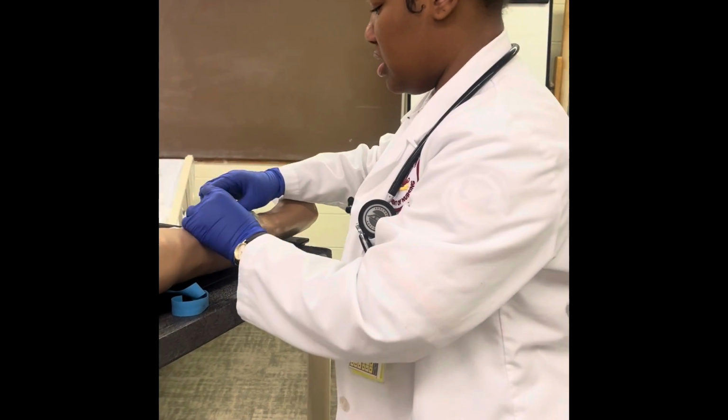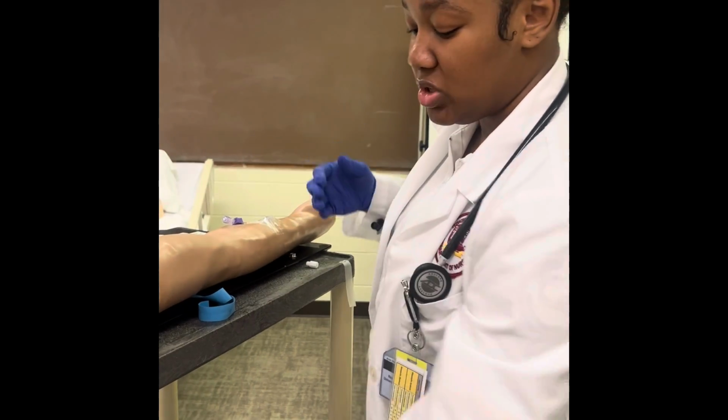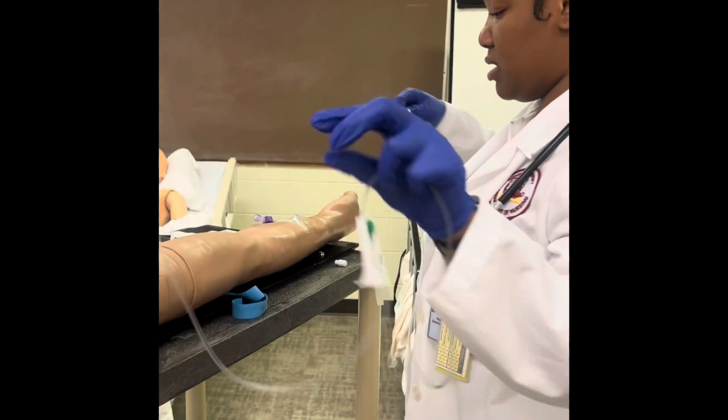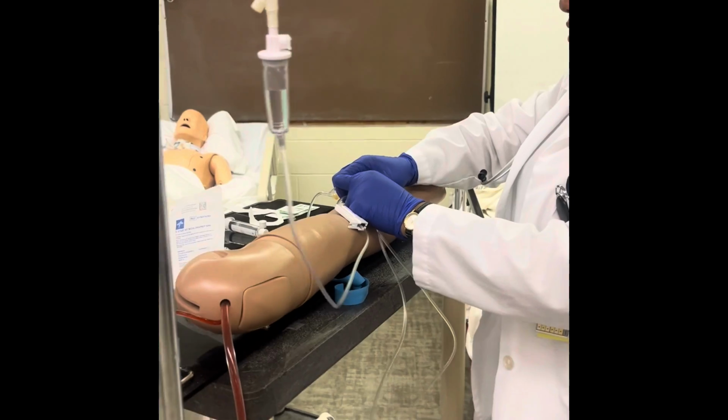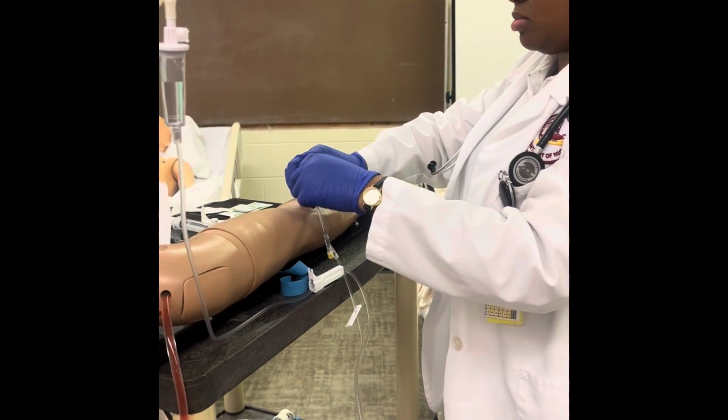Alright, and then I would clamp it off, but since I'm going to go ahead and hook him up to some medication, I can unclamp it, make sure both my clamp tubes are unclamped, and hook it up.